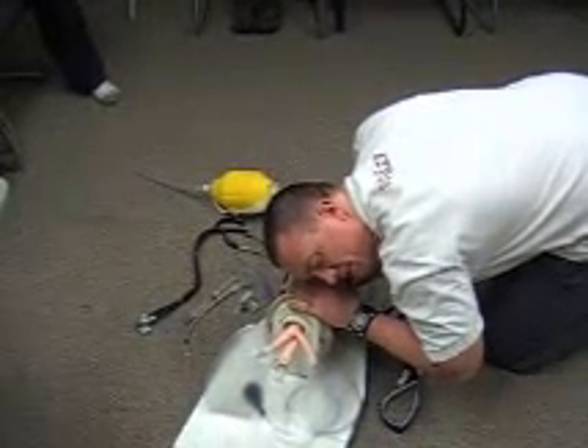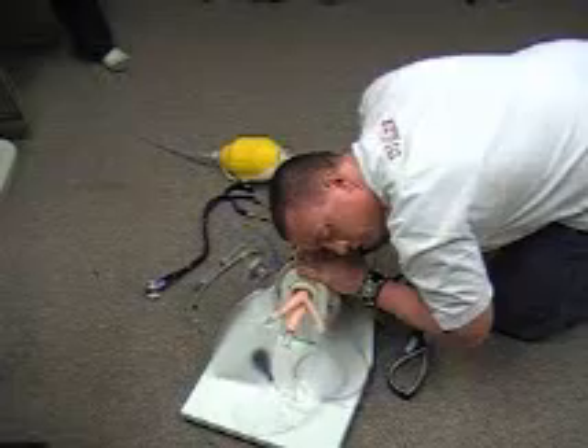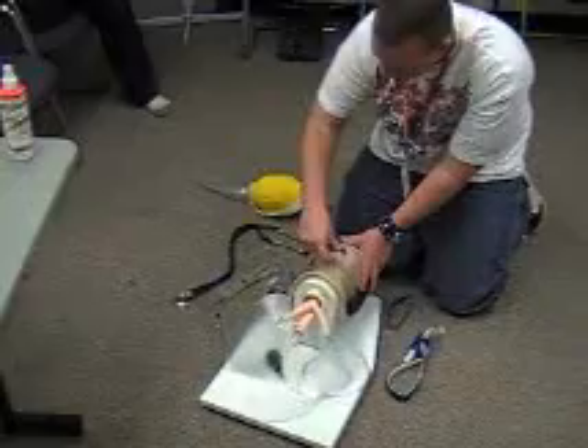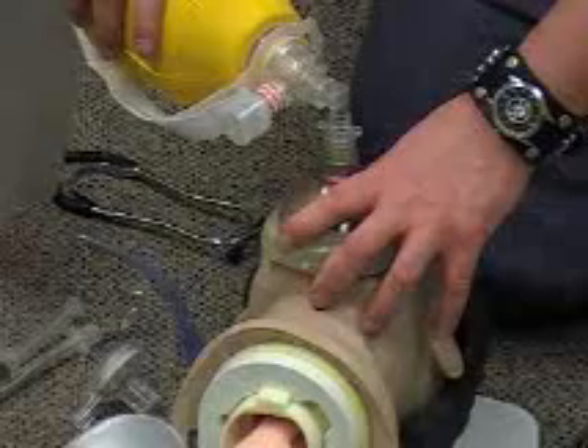I'm going to look, listen, and feel for five to ten seconds to check for any signs of breathing. There are no signs of breathing, so at this time I'm going to insert an OPA. The patient does accept the adjunct, so I'm going to begin bagging the patient with high-flow 100% oxygen.